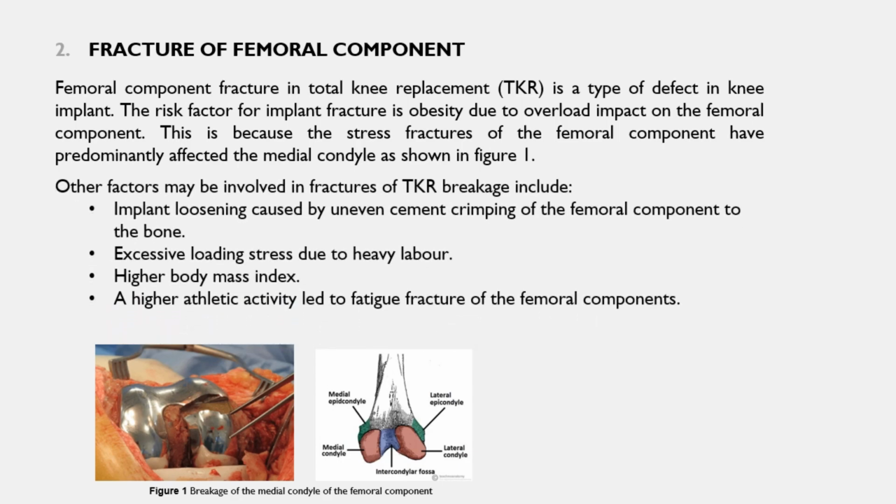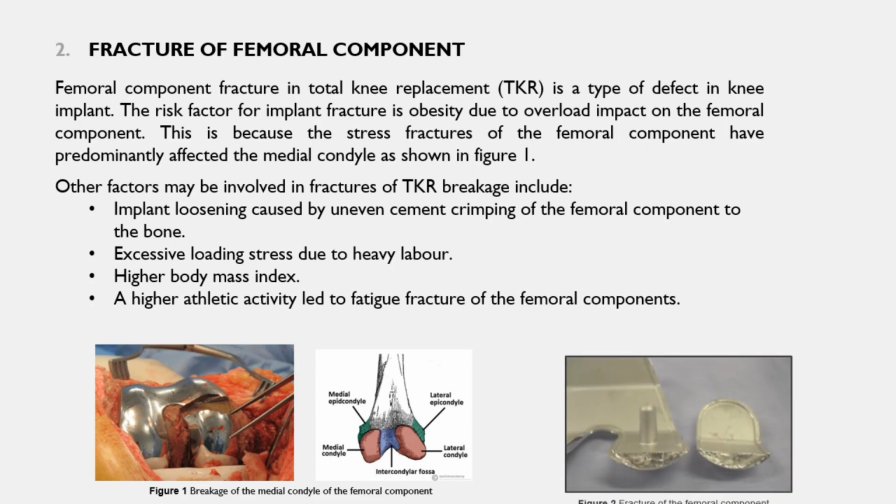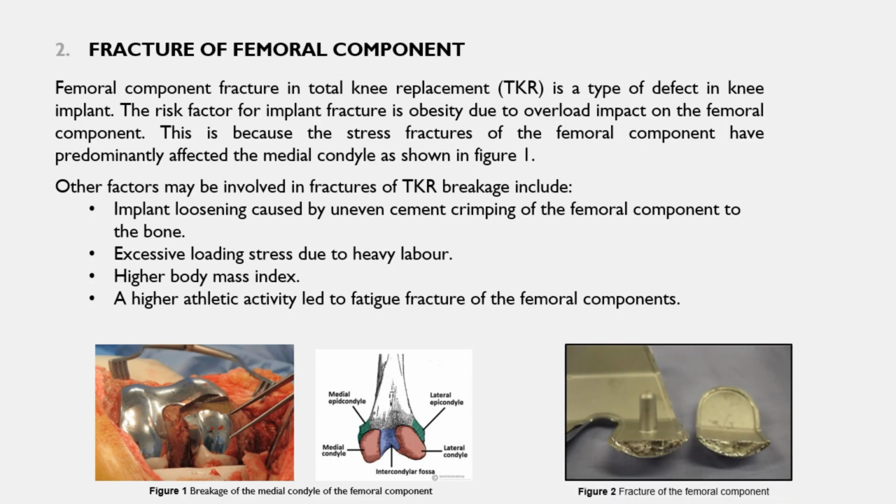Other factors involved in fractures of total knee replacement include implant loosening caused by uneven cement crimping of the femoral component to the bone, excessive loading stress due to heavy labor, higher body mass index, and higher athletic activity. Figure 2 shows an example of fractures of the femoral component.